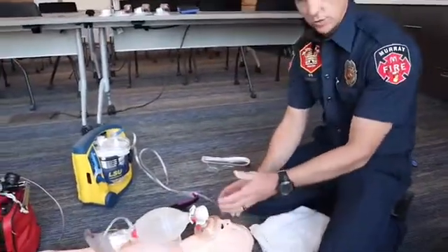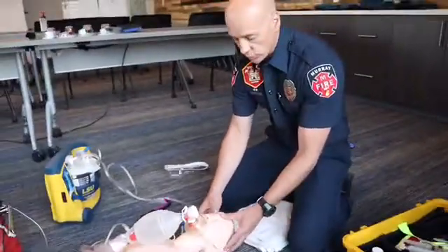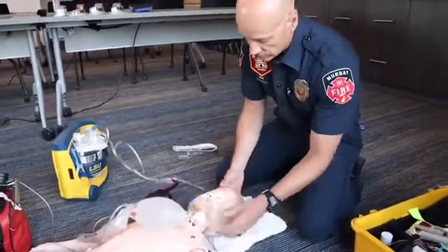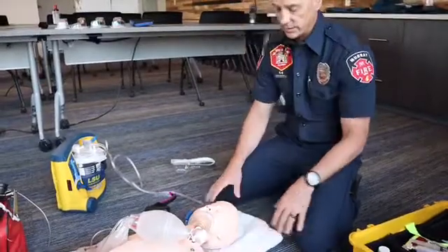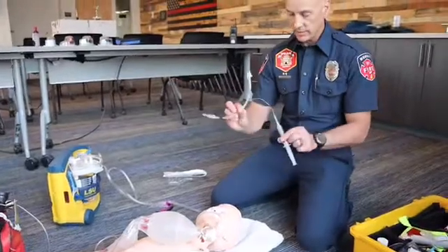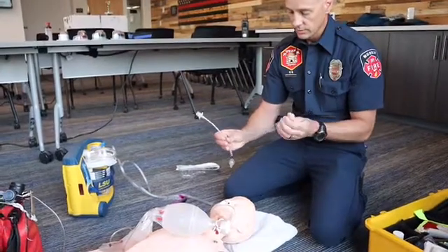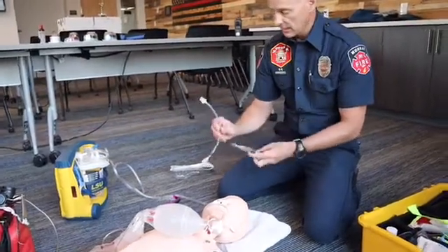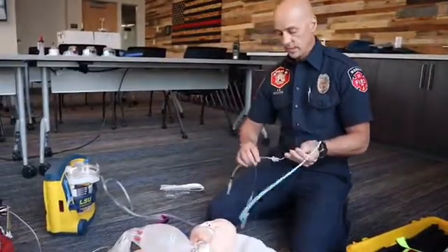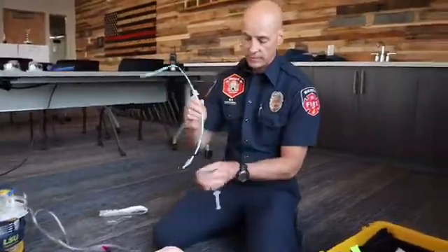Positioning of the patient is important. With this particular device we don't want to hyperextend the airway like we used to with traditional laryngoscopy — we want the patient in a neutral position. If you have to manipulate the patient's head to obtain that neutral position, you can use a towel or something similar. Also, select the appropriate tube size. Here I have a 5.5 tube — test the cuff to make sure the integrity is there.